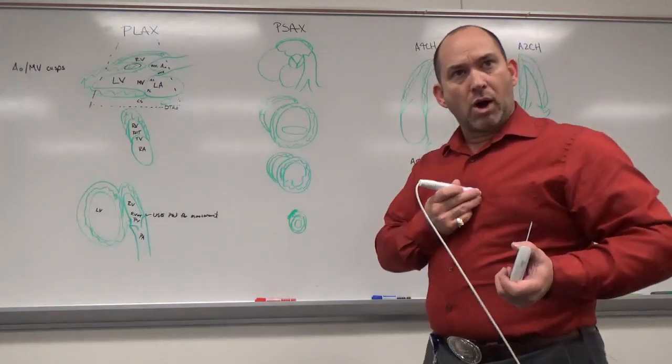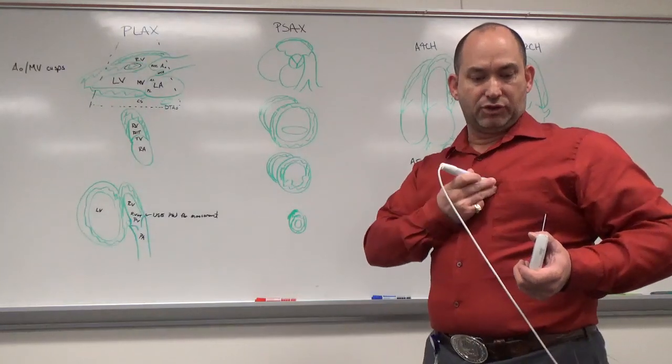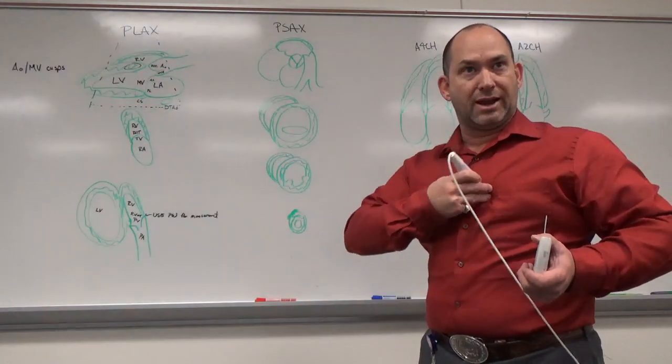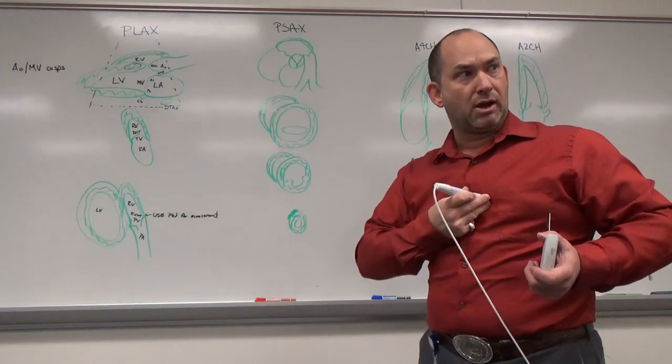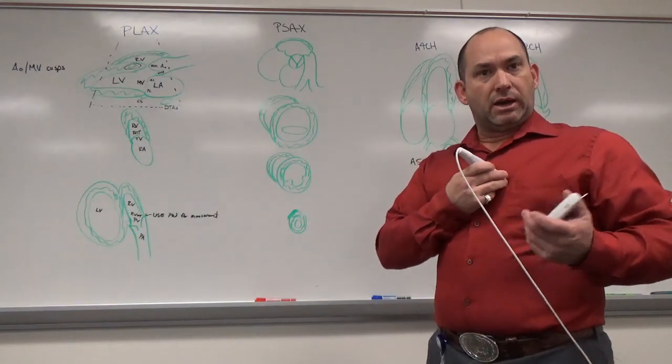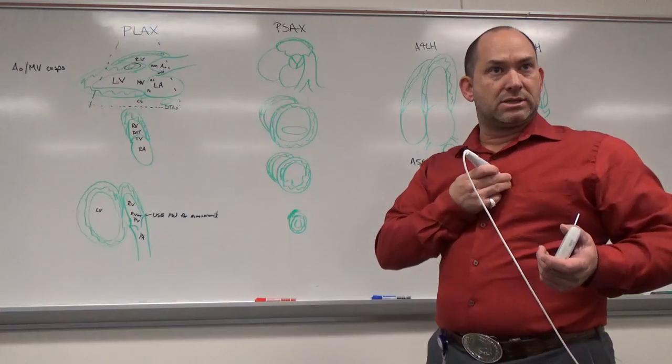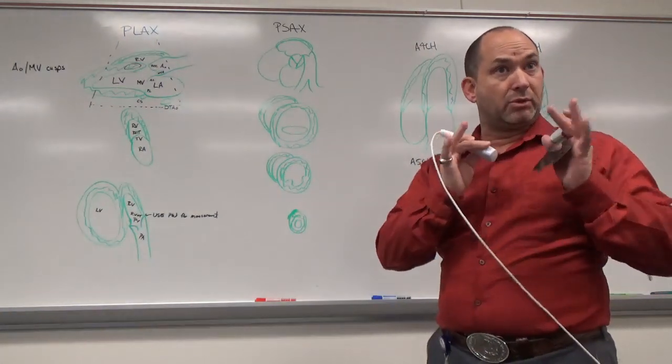So what I do is I walk my transducer, I slide it and inch it. So I move up and then angle, and then up and then angle, or I go down and angle up, and down and angle up. That's how I do it. Tammy uses a circular motion, so she'll just go like this, doing little circles trying to clear up the window.